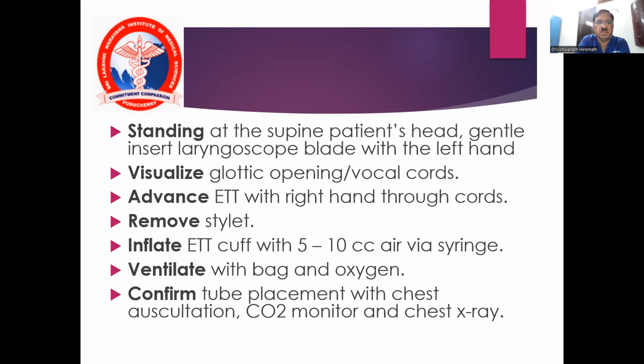Oxygenate. Then after pre-oxygenation for at least 3 minutes, better 5 minutes, open the mouth, oral cavity, by chin lift and head tilt.